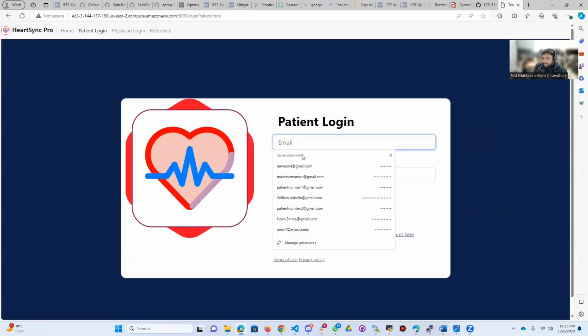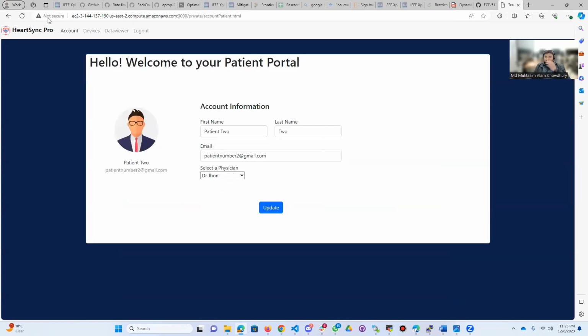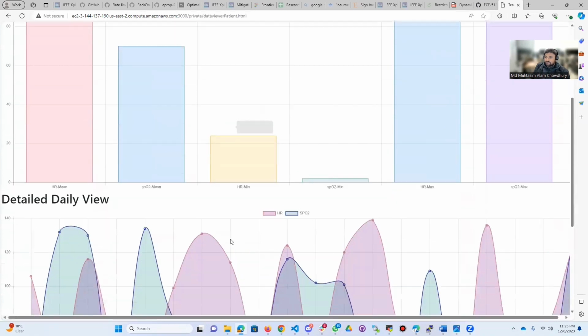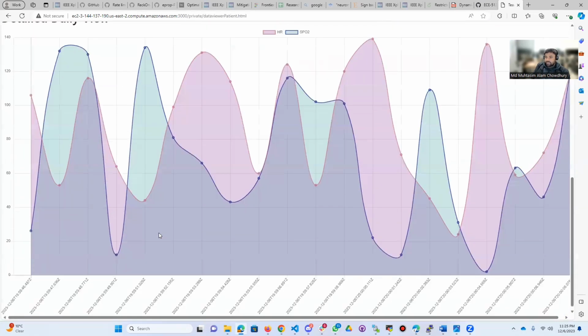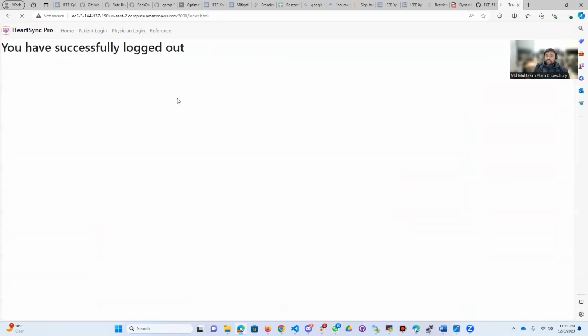I can show you one of the datasets that I have. Let's log in. Here you can see the device is already there. The device name is this, and it's updated. We already fed data here, so it's fine. It will show the data in different ranges. We have collected it to make it look nice, and then log out.